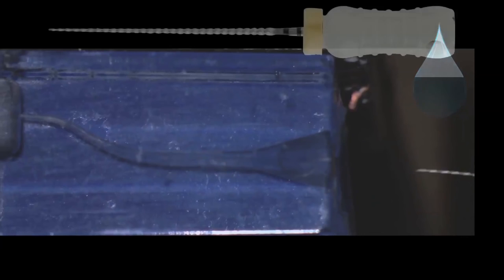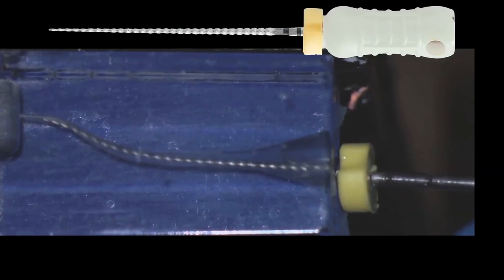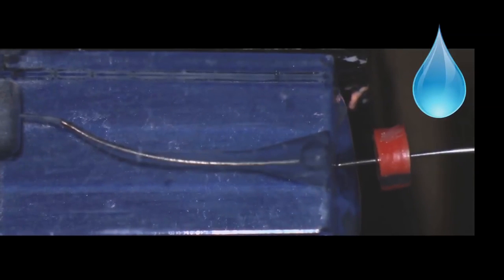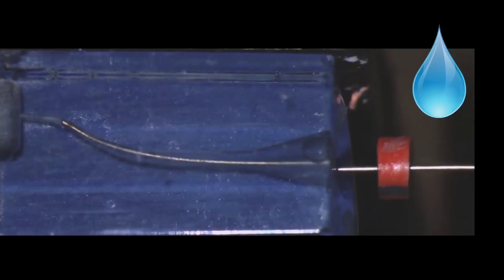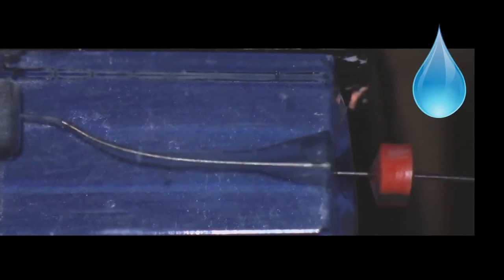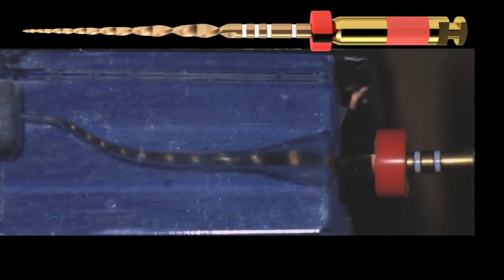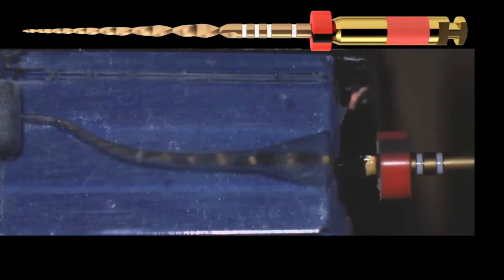Irrigate, irrigate. We ascertain that the canal is still patent with the file that established working length. You can see the deeper penetration of our chemicals during root canal therapy with the side-vented irrigation needle. And now we will go in this instance all the way to working length with WaveOne Gold.